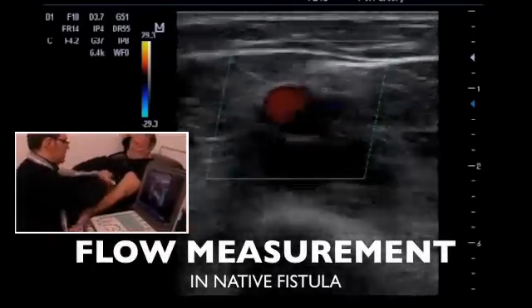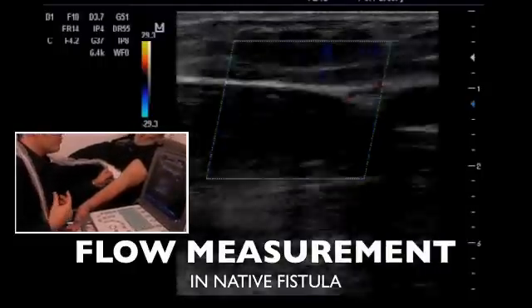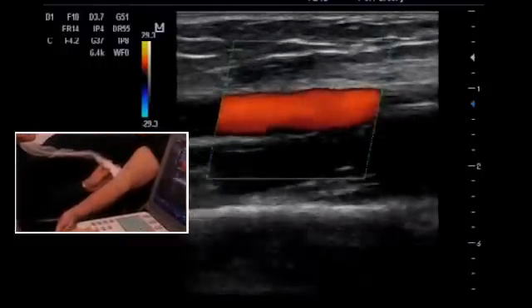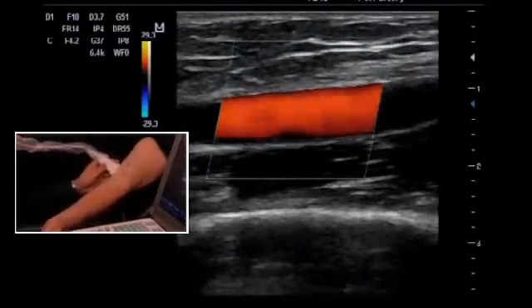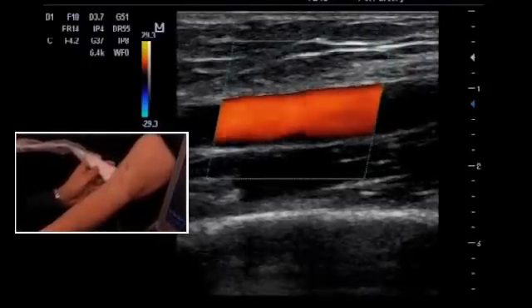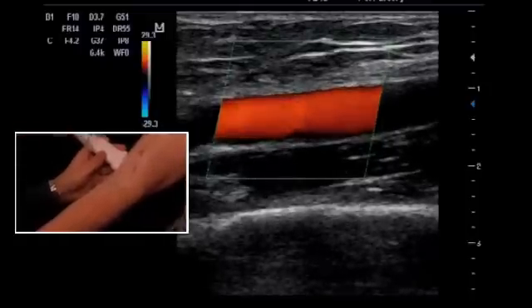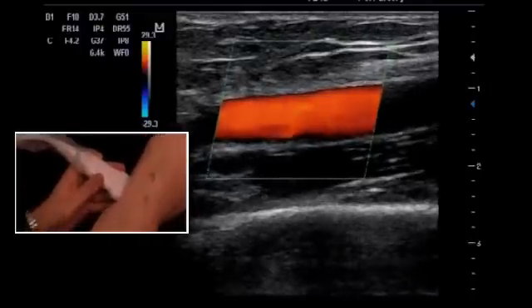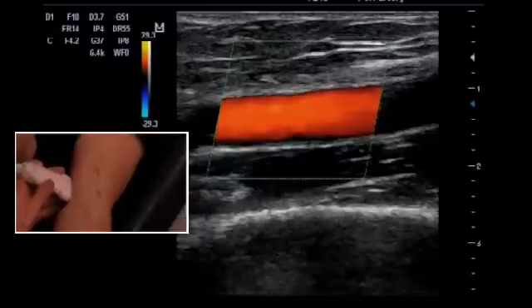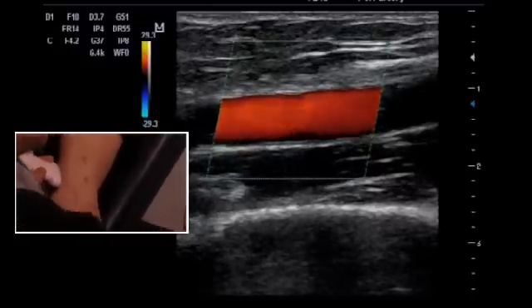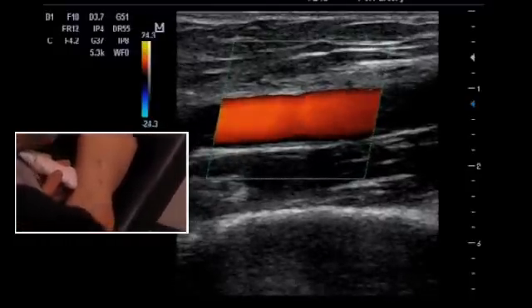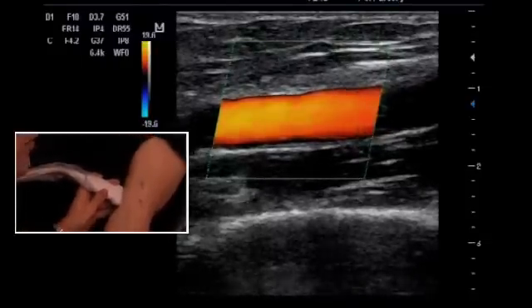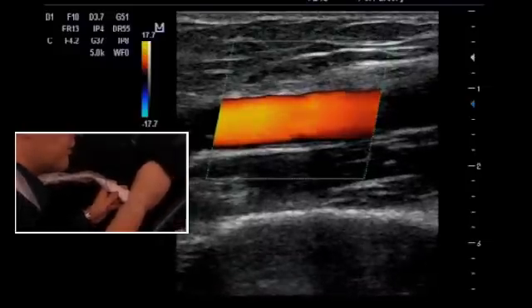We see nice laminar flow within the brachial artery. The blood is streaming uniformly red towards the transducer, which is why the vessel is nicely filled in red. We will optimize the PRF a bit.